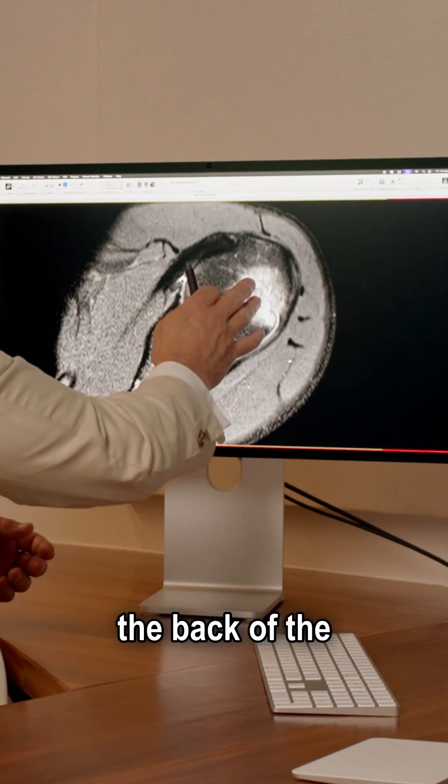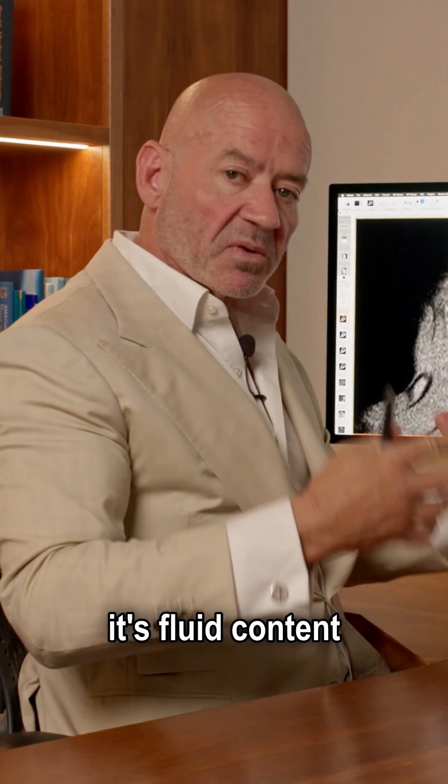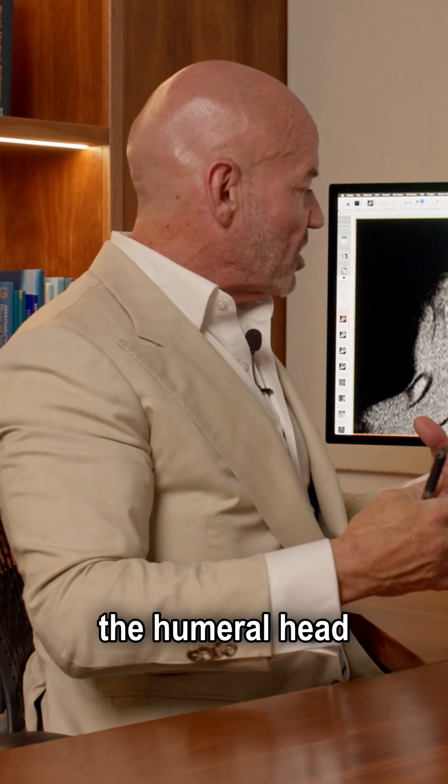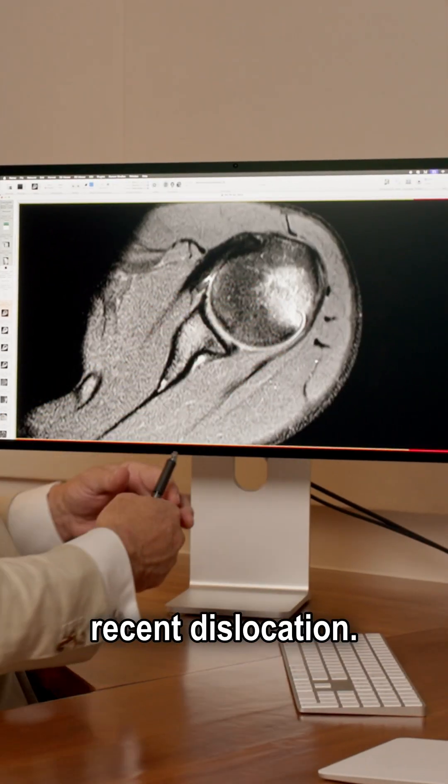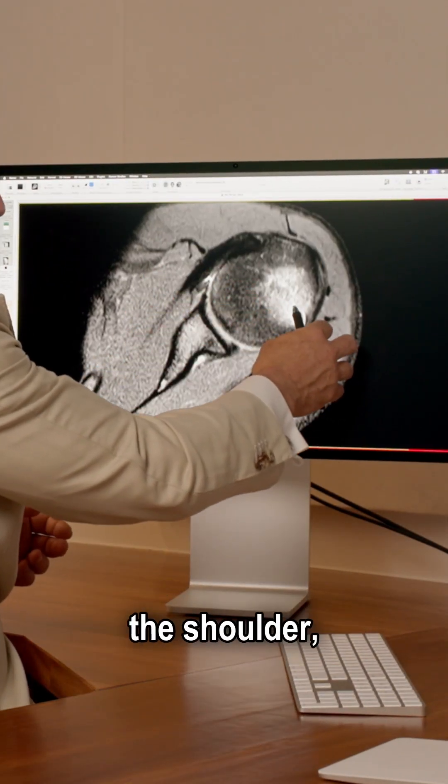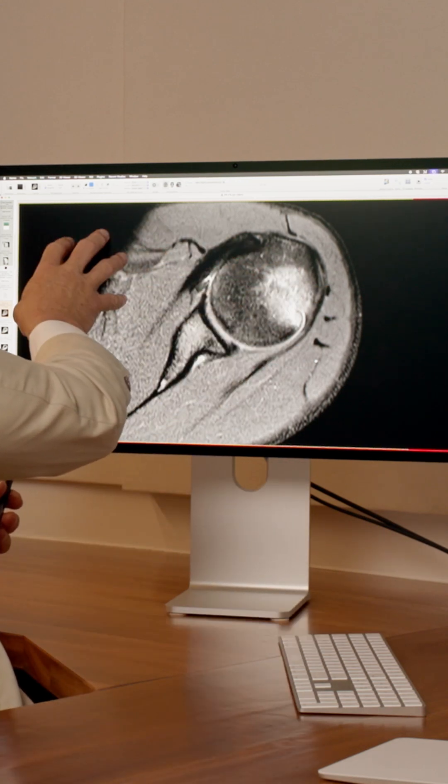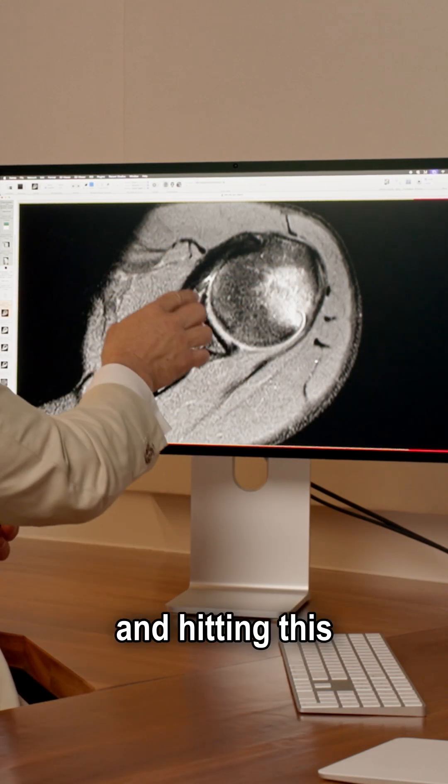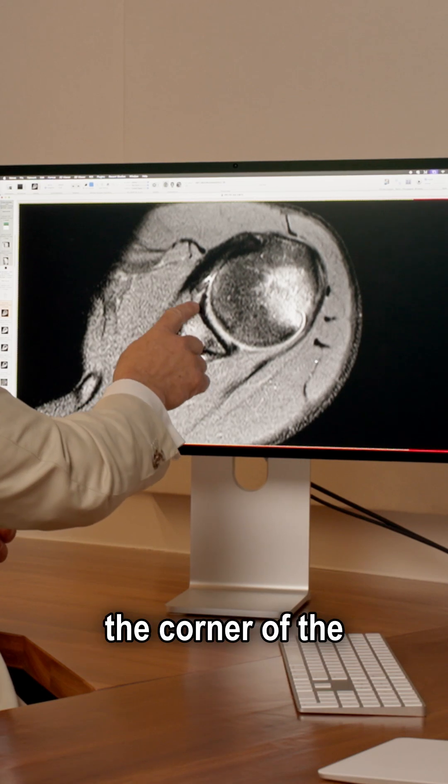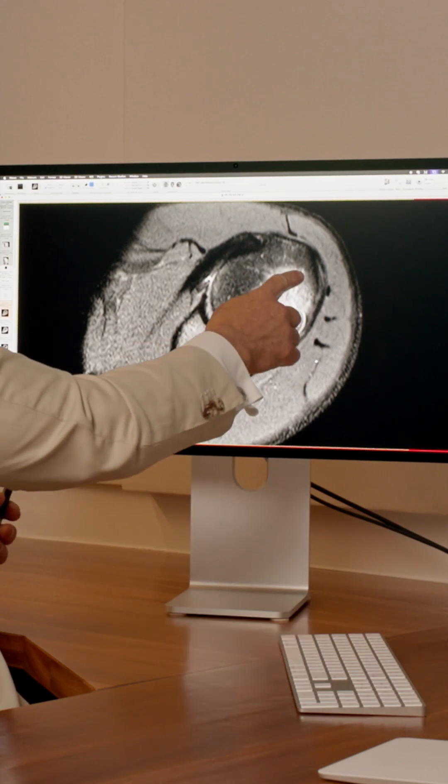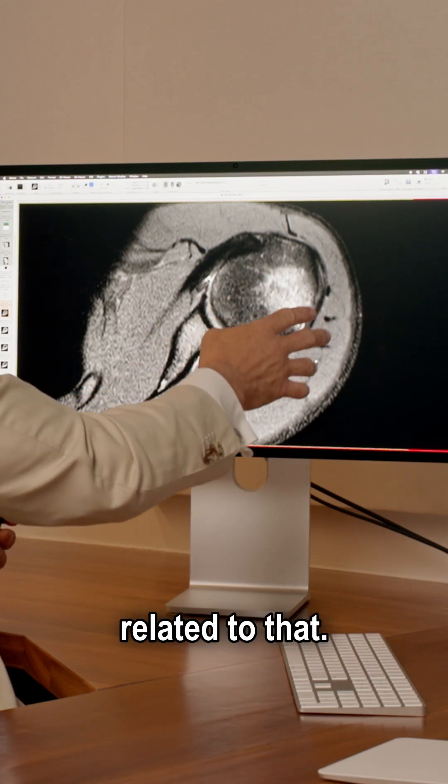This bright area in the back of the humeral head is bone bruising. It's fluid content in the back of the humeral head related to the recent dislocation, and he's got a dent here in the back of the shoulder, an indentation there. That's from the shoulder coming out, dislocating out here and then coming back and hitting this corner of bone here, the corner of the socket which dents here, and then you get bone bruising related to that.